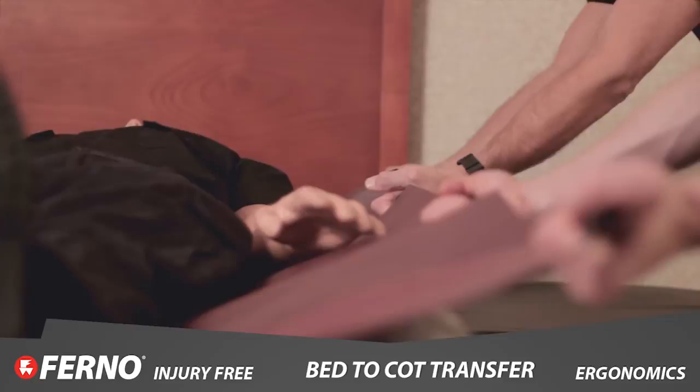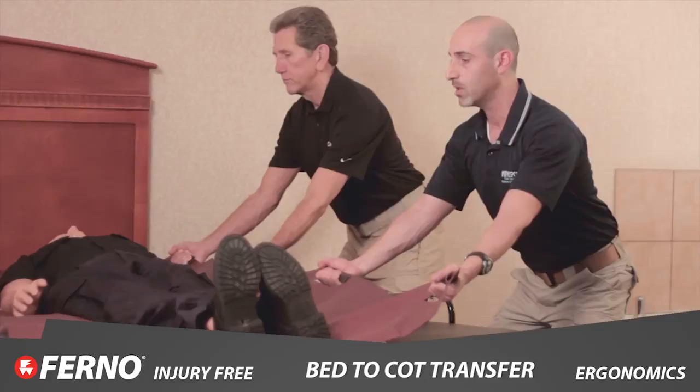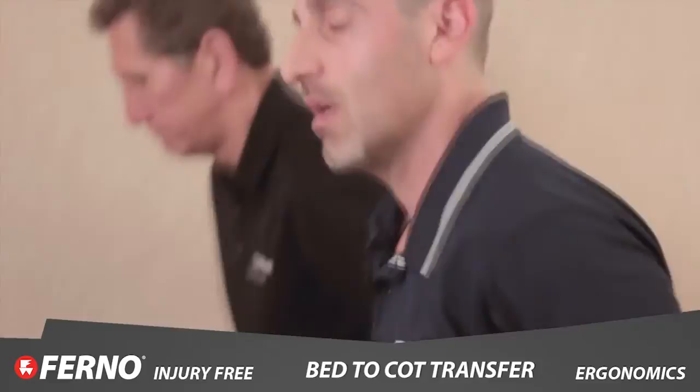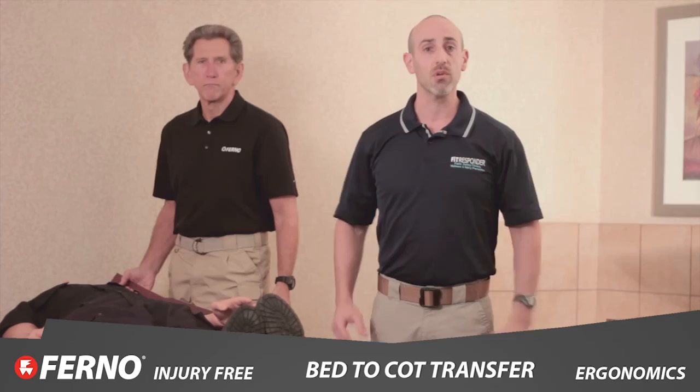Head comes up, shoulders come back, and with our normal count of one, two, three, pull — with very, very little effort we're able to take this patient and pull them from bed to stretcher. The patient is now ready to be packaged and taken to the hospital.